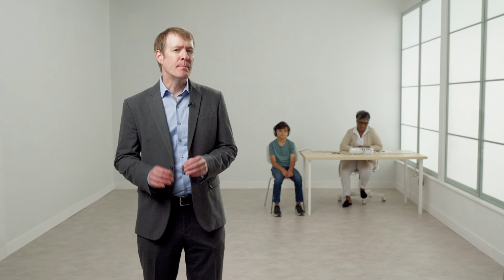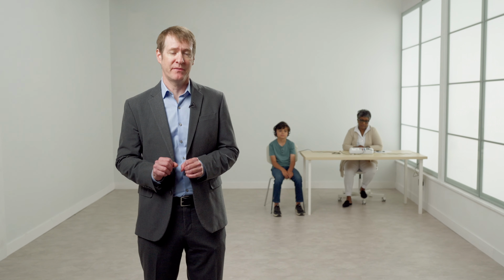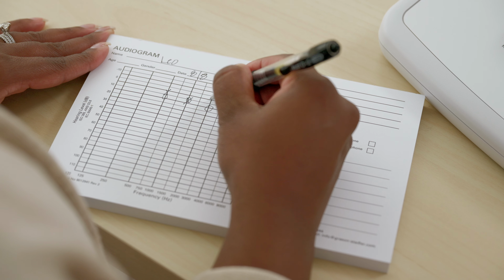The type of evaluation performed with the GSI 18 will vary depending on the facility. Be sure to follow the test guidelines of your facility to complete the evaluation. This may be one presentation at a single level for each frequency, or a threshold evaluation at multiple frequencies. Regardless of the test, you will need to record the results manually on the included audiogram pad or another form of manual recording.